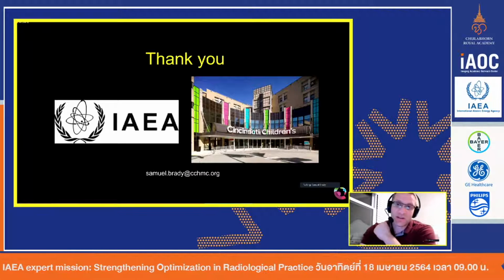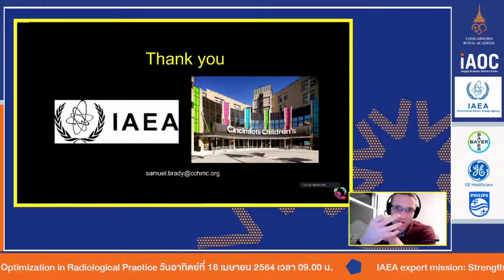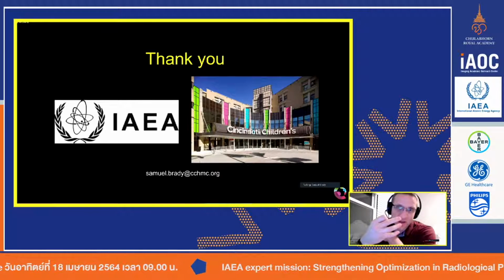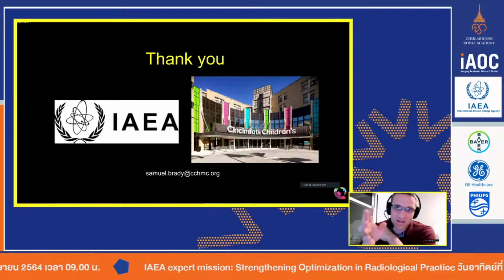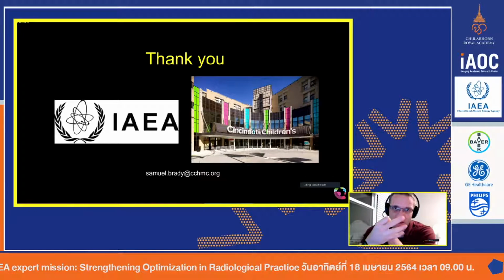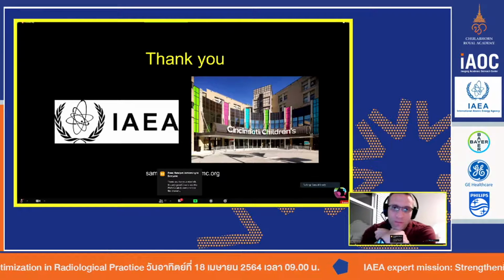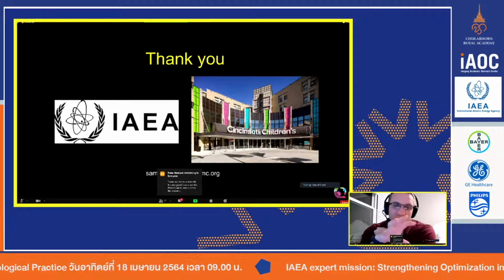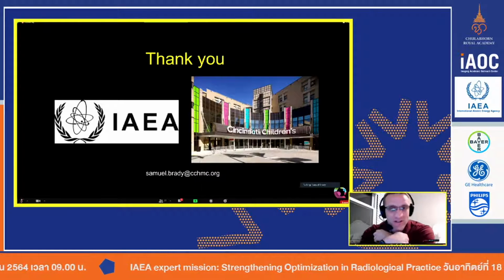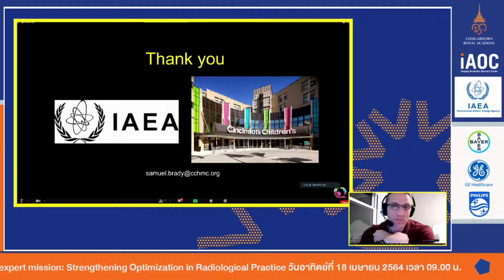All right, so that's kind of a whirlwind. We talked about the three main features we're trying to optimize for image quality: spatial resolution, low contrast optimization, and noise. And we just talked about all of the different ways the fluoro system creates an image and how they will directly affect these three optimization parameters. And I think the overall take-home message is, when you're sitting or standing table side operating the system, there's actually not a lot you can do to optimize your image quality. Most of your image quality is optimized before the patient walks into the room.